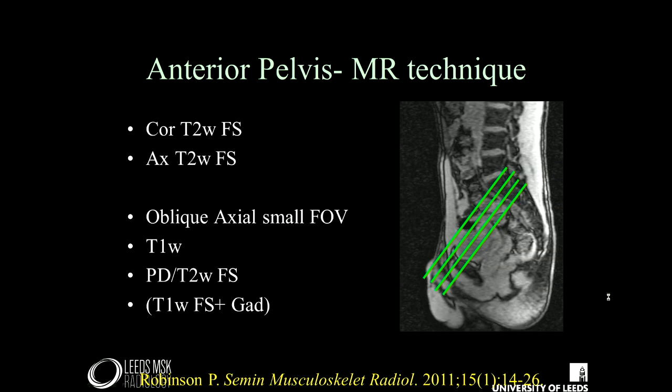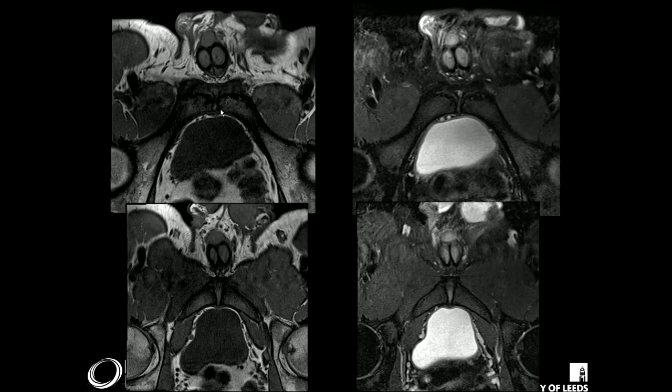These are the sort of images you get. Here are some T1-weighted images through the anterior pelvis. You can see the pubic bodies and the junctional area with the capsule, the adductor and rectus abdominis tendons, and more inferiorly more adductor and capsular tissue. On the T2-weighted, you can see the old apophysis, a bit of fluid, and beautiful detail of the symphysis pubis itself.